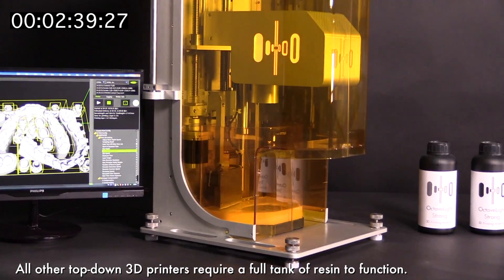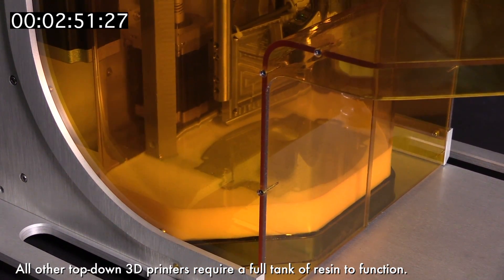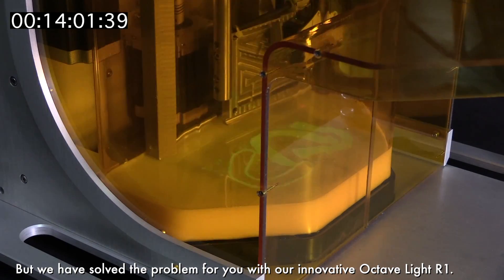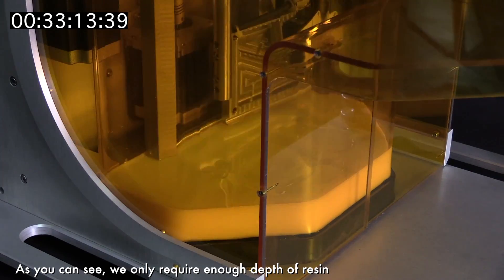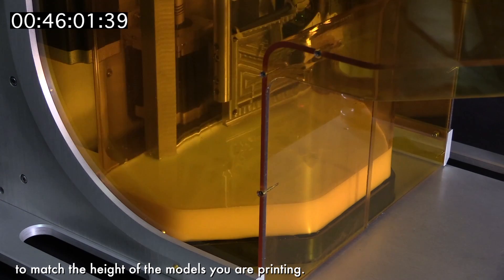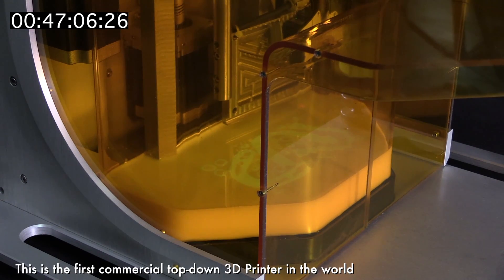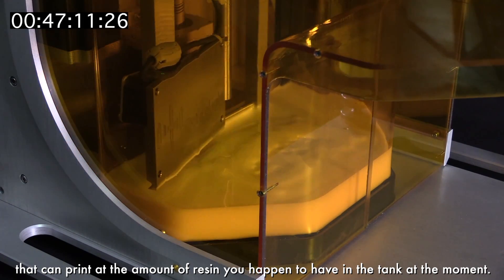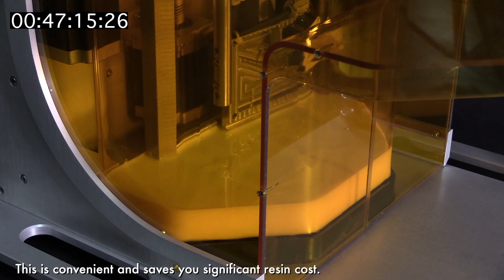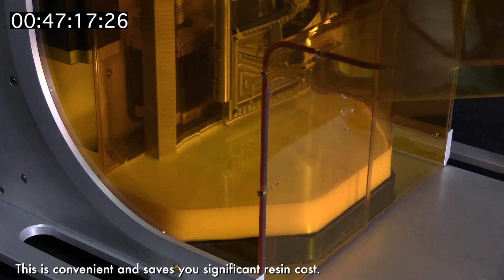All other top-down 3D printers require a full tank of resin to function. But we have solved that problem with our innovative Octave Lights R1. As you can see, we only require enough depth of resin to match the height of the models you are printing. This is the first commercial top-down 3D printer in the world that can print with only the amount of resin you happen to have in the tank at the moment. This is convenient and saves you significant resin cost.